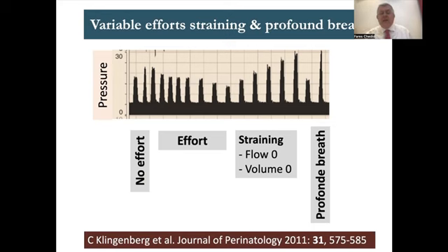If you look at the flow, you will find it zero, like no flow coming. And you look at the volume, it's zero because he's really blocking his chest. Then the machine will start shooting up and up his pressure while he's training, till at some stage he says, I'll take a deep breath. And he takes a deep breath, and while the PIP was already very high, with it the volume will go very high.